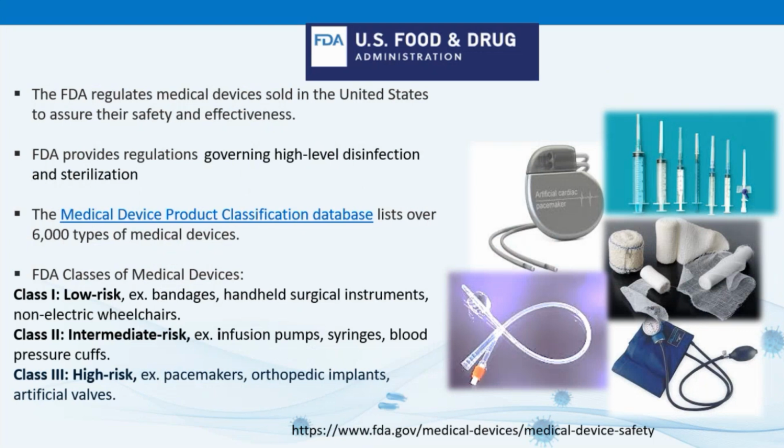Now, who regulates these devices? The FDA Center for Medical Devices and the Center for Device and Radiological Health regulate the over 6,000 medical devices in the United States. They require medical device manufacturers to provide written reprocessing instructions with a specific reprocessing regimen that is use-specific, clearly written, and comprehensive, and it tells the user how to thoroughly clean the device and the appropriate disinfection process. They also provide regulations regarding high-level disinfection and the sterilization of these over 6,000 devices.